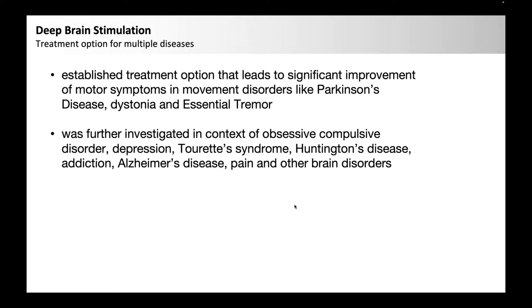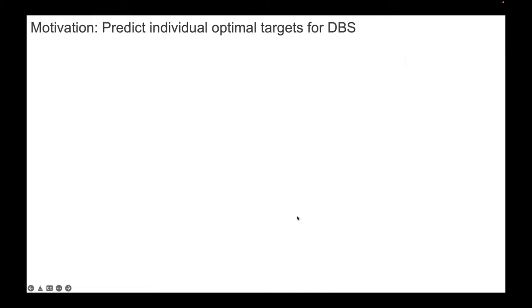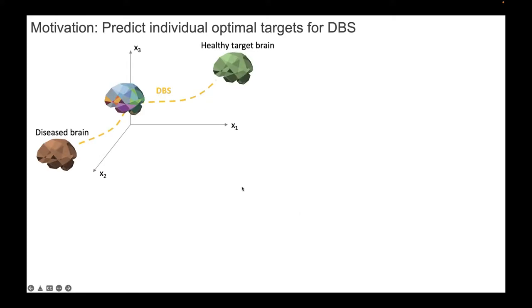And we want to also circumvent the burden for patients who go through this treatment, meaning they get surgery on the brain, right? So it takes maybe up to 2 hours with lots of measurements before and after. Then they need to calibrate the electrode, what exact frequency, what pulse should be programmed, what's the best setting of the stimulus for the patient. And then afterwards, there are still some patients who actually see sometimes worsening of their symptoms. So that's what we don't want, of course. So we need to understand better.